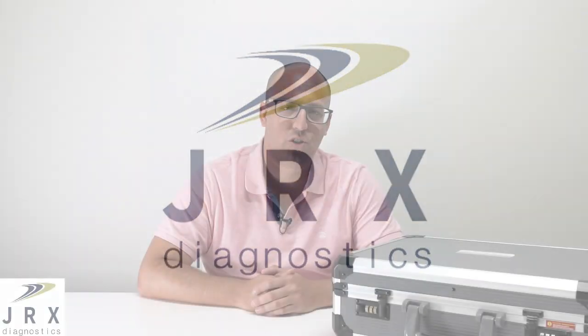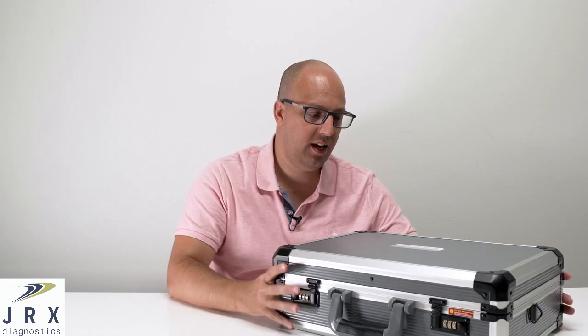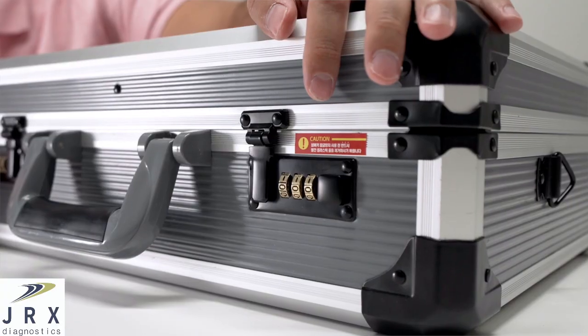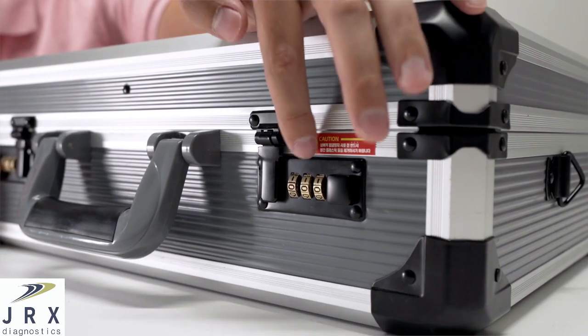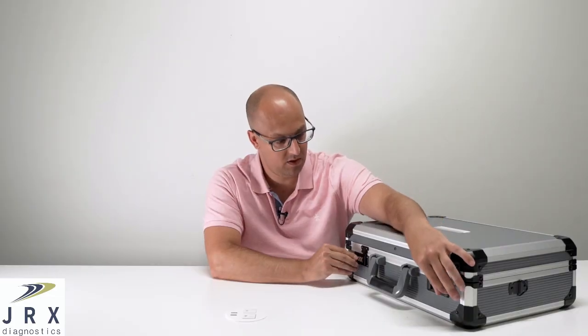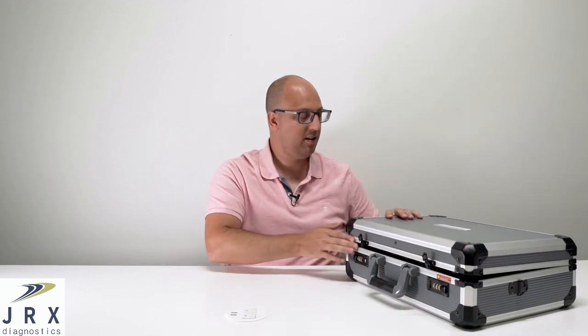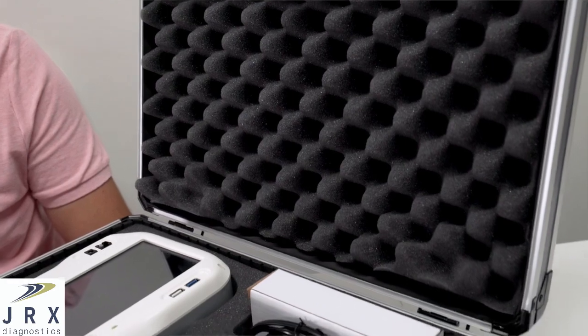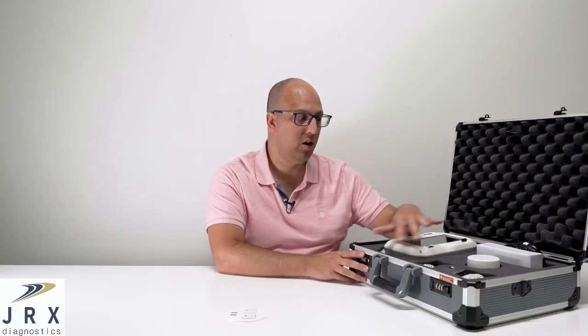Hi, I'm Rob, and today I'm going to show you the portable x-ray system designed by Livermore Tech and Aspen Imaging. As you'll see, it comes in this hard shell and lightweight carrying case. It has a handle on it and a customizable numeric passcode so you can protect your equipment. We designed custom foam inserts to protect your portable x-ray system and all the accessories.